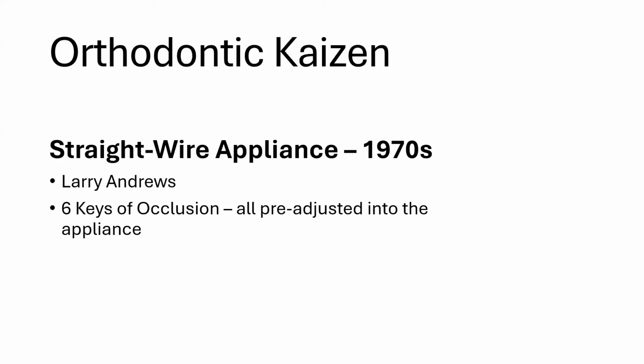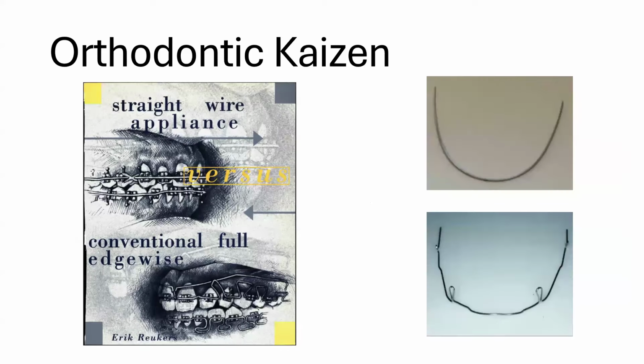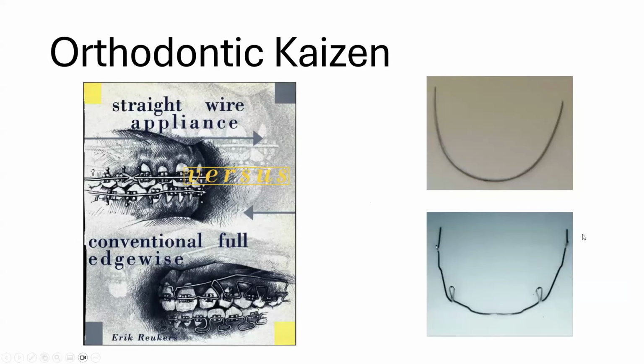We all have the same goals, but there's been a few of these pioneers that are taking us to the next step in getting to these goals. Larry Andrews, also an innovator, 9 patents throughout the course of his life. And he brought us the straight wire appliance, thank goodness. So we went from these highly detailed wires that we had from Dr. Angle, where we were basically customizing every single tooth in the mouth, to the straight wire appliance, where the idea was we could get the right bracket in the right spot with the right prescription, and you could put in a straight wire and you'd get the result we were all looking for.